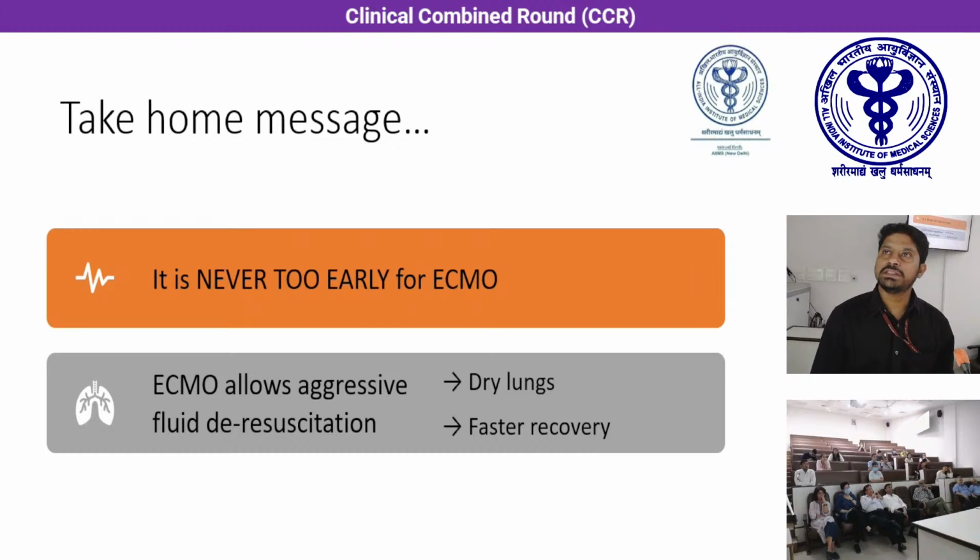So take home message, it is never too early for ECMO. And ECMO allows aggressive fluid removal, and this leads to dry lungs and faster recovery. Thank you.